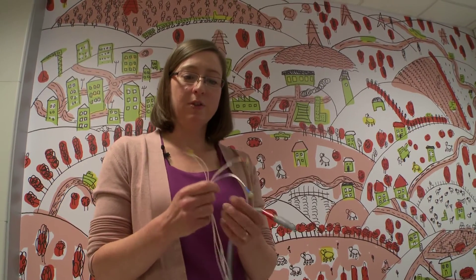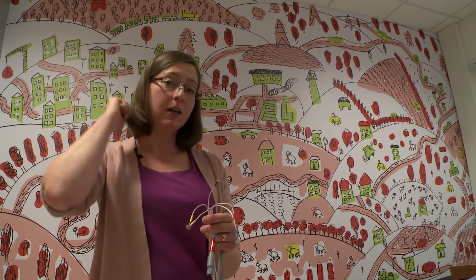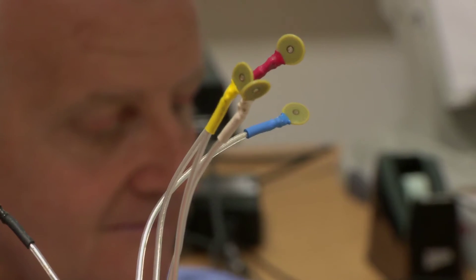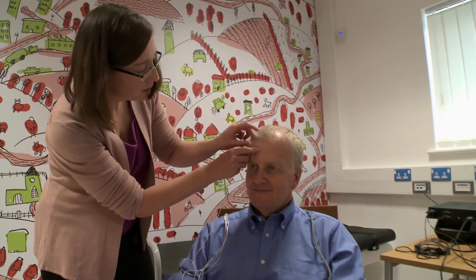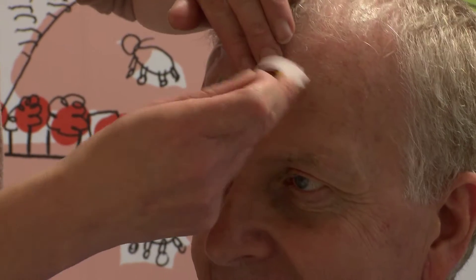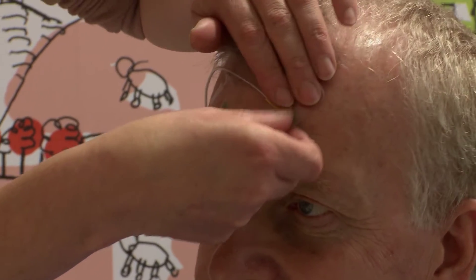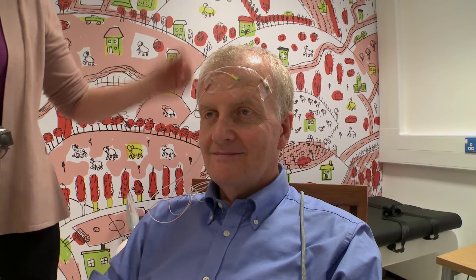The next step is for us to attach these five little coils to Stefano's forehead. They're very small and we just attach them with tape — three of them go across the top of his forehead and one behind each ear. You can see I'm going to stick this on just with sticky tape, so it's very easy to take off after we're finished.